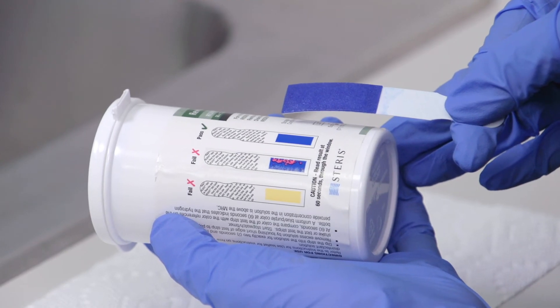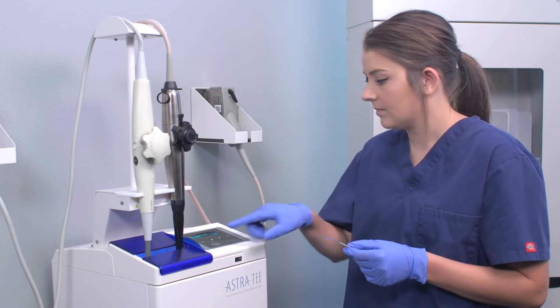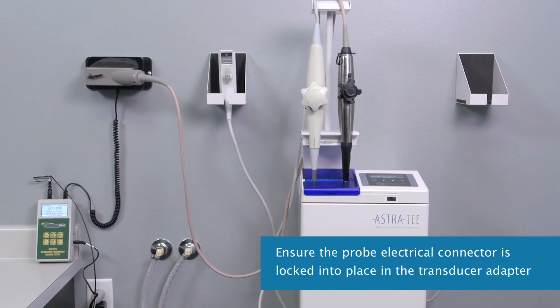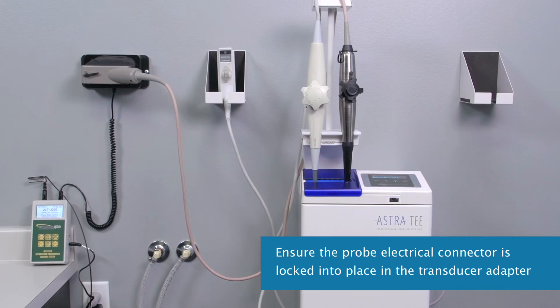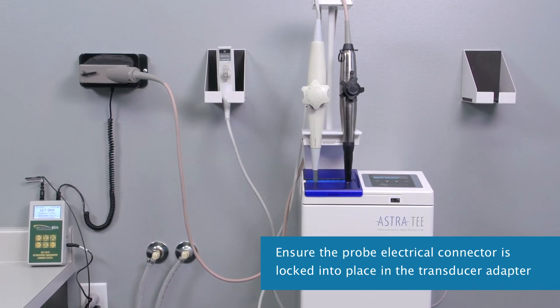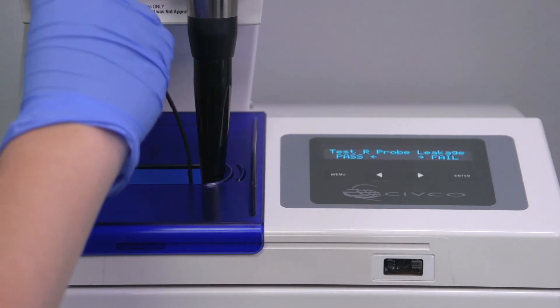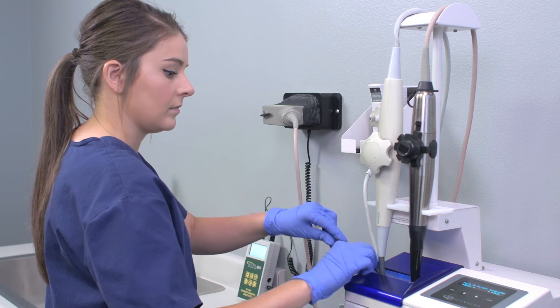Compare the strip to the bottle chart. After you press the Pass arrow, it is time to perform the TEE probe electrical leak test — for Astra TEE users only. Make sure the probe electrical connector is locked into place in the transducer adapter, then insert the conductivity probe into the chamber and select Full Test on the leak tester.